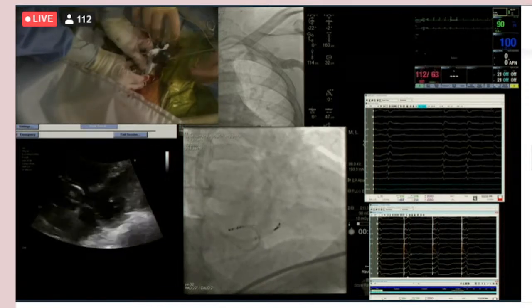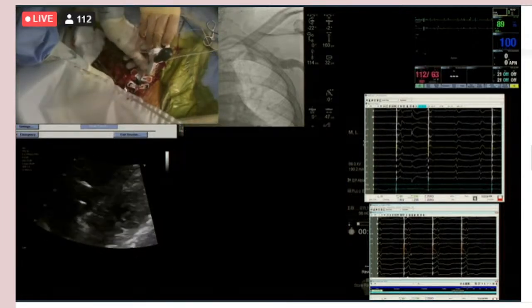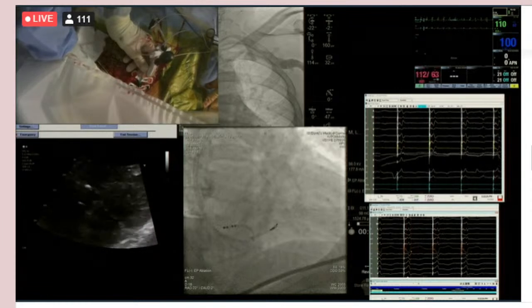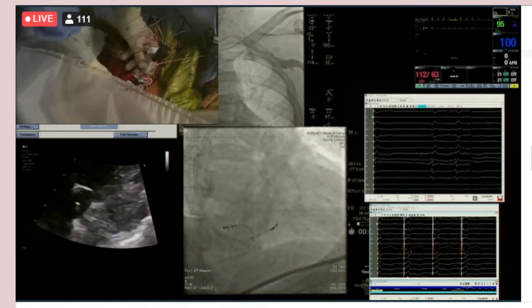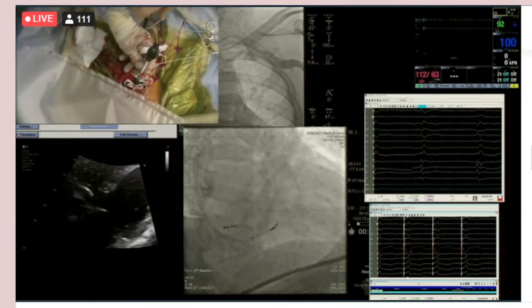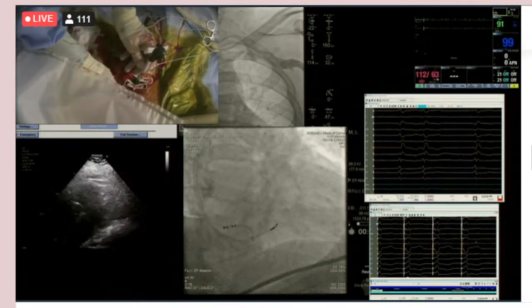Okay. Got it. So we've got an impedance that's just below 500 there. 504. Okay, let's. 506. So we're just above 500 there. Let's go on sensing and see if we can see a left bundle potential there. In sensing, you're going to go bipolar for sensing? No, this is unipolar. This is all unipolar. I'm still basically just looking at the helix. Got it. What's the helix doing? Do you see anything there?